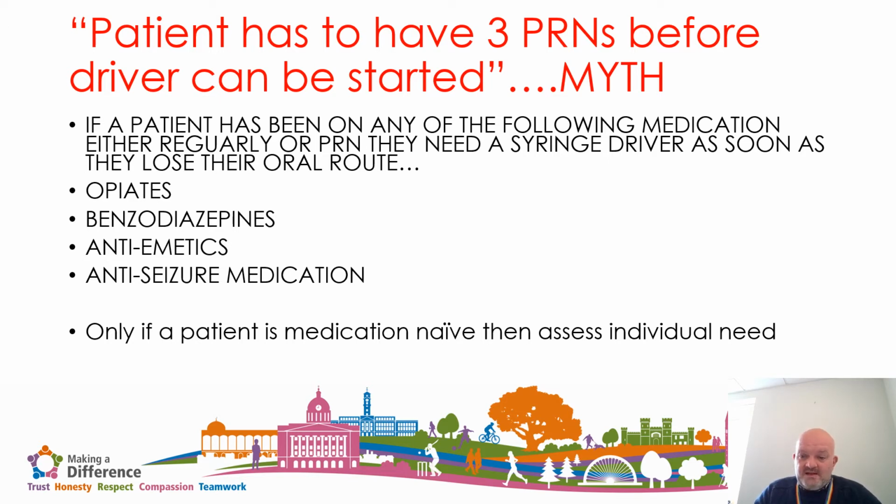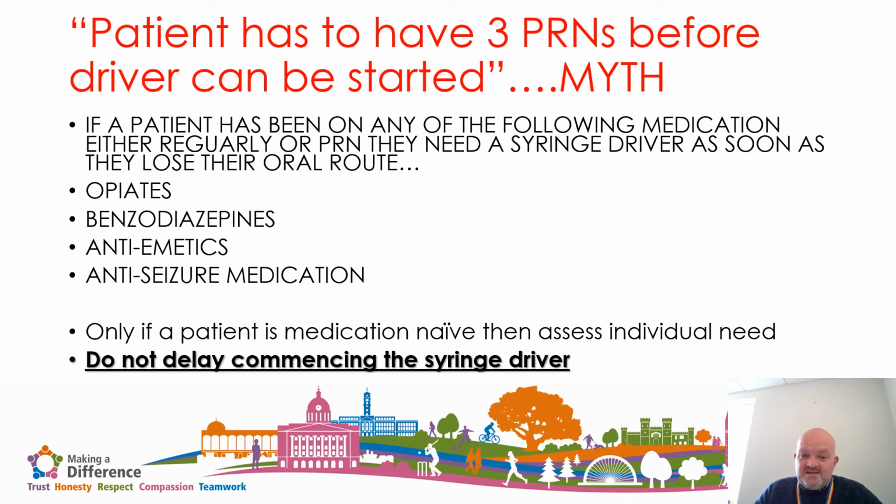But the important thing with this, and I think this is an issue that the myth has sort of caused, is that we don't want to delay the commencing of the syringe driver. So nothing we should do should delay the commencing of the syringe driver.